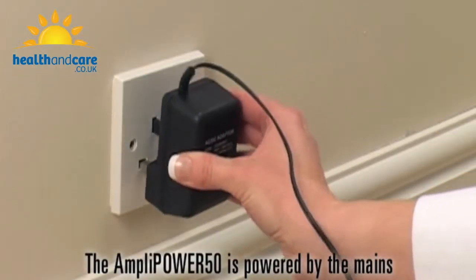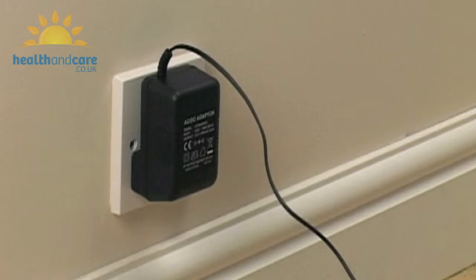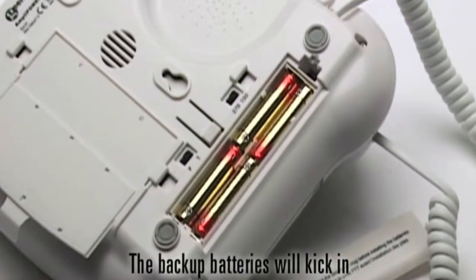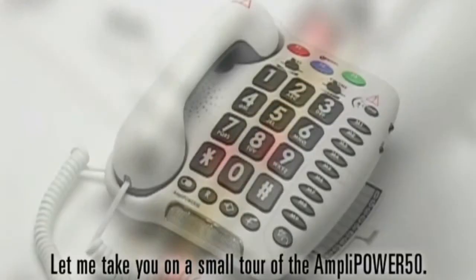The AmpliPower 50 is powered by the mains. This means additional features can be enjoyed. However, in case of a power failure, the backup batteries will kick in and there will be a seamless transition to this alternative power supply.